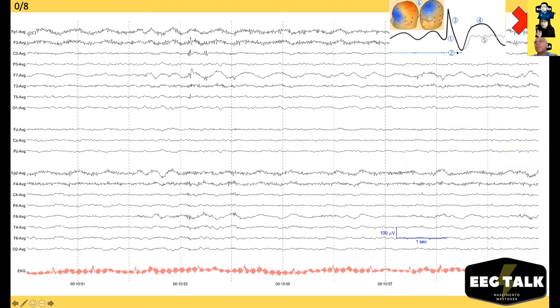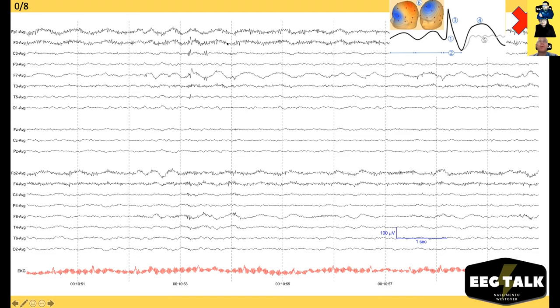In the new definition, for duration it just says different from the background — no specific millisecond range. Number three is about asymmetry of the peaks: if you divide the wave into two half waves, the rising and falling slopes should be different. Number four is whether it has an aftergoing slow wave, which is suggestive of being epileptiform. Number five has to do with whether it jumps out of the background — whether it is an anomaly relative to the surrounding background. Number six is whether it has a physiological field, almost always from the scalp.